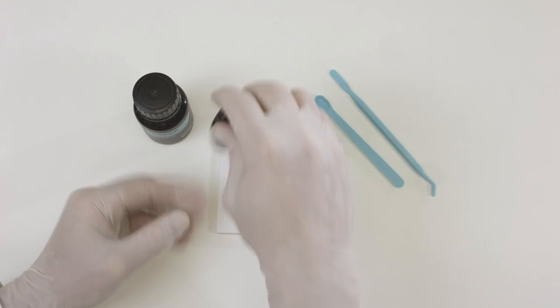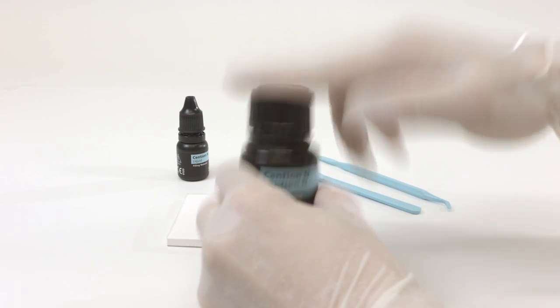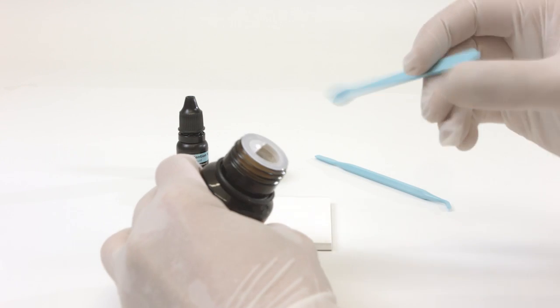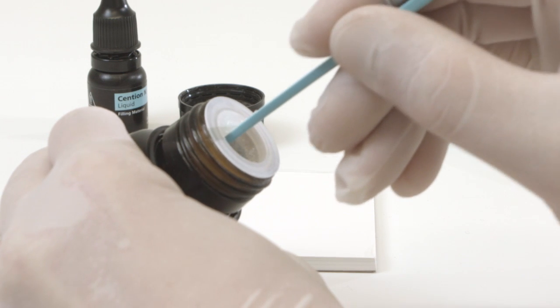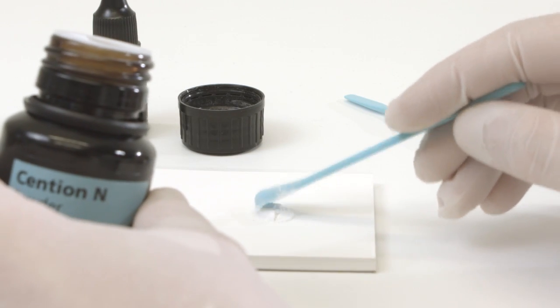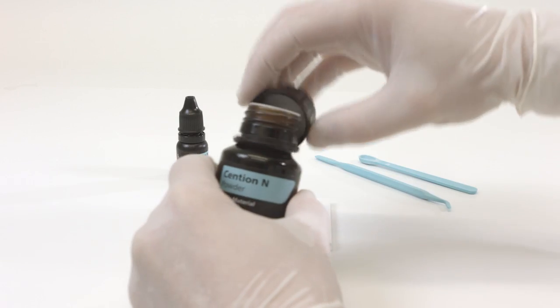After use, close the bottle tightly. Shake the bottle containing the powder before use and then remove the required quantity using the measuring spoon. Wipe off excess powder at the plastic insert of the bottleneck and place the material on a mixing pad or glass plate. The mixing ratio of powder to liquid is one measuring spoon of powder to one drop of liquid. Close the bottle tightly after use.